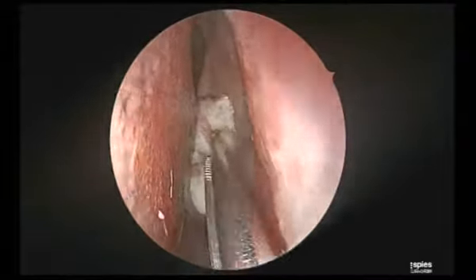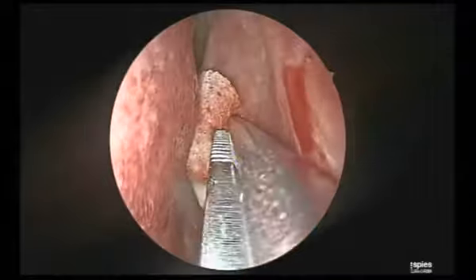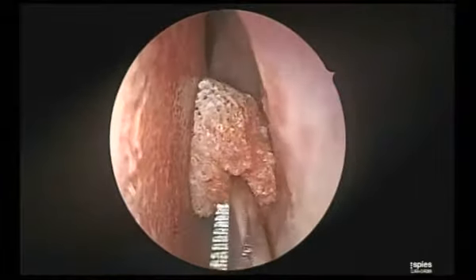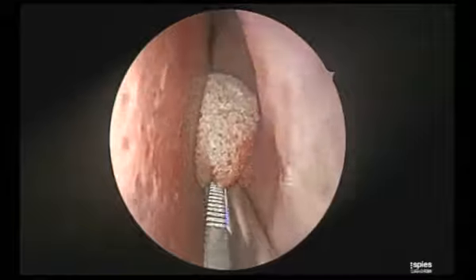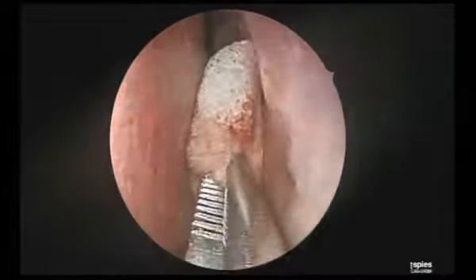Like you mentioned, I always use the merocell for the reason that it is a soft thing, absolutely atraumatic. You can squeeze it into any narrow spaces you want, and it opens up the spaces. So what I do, I use two long merocell pieces and divide them into 8 to 10 pieces of different sizes, so I can use them according to the location where I want to use.